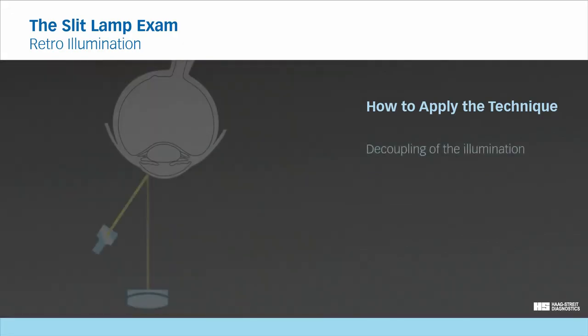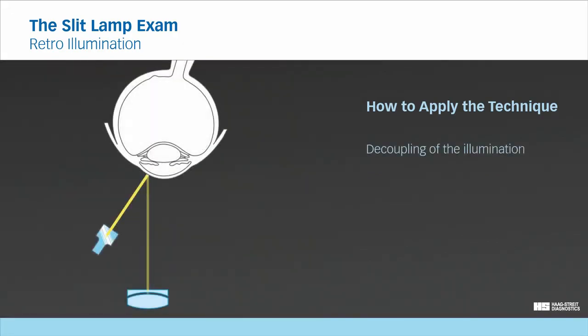Due to the common pivot of illumination and microscope, the directly illuminated tissue will be in the center of your field of view. In contrast to this, the retroilluminated area is offset. In lower magnifications, this is not a problem, as the field of view is sufficiently large. But in higher magnification, demonstrated in the smaller optic, the retroilluminated area might be too far offset to observe.